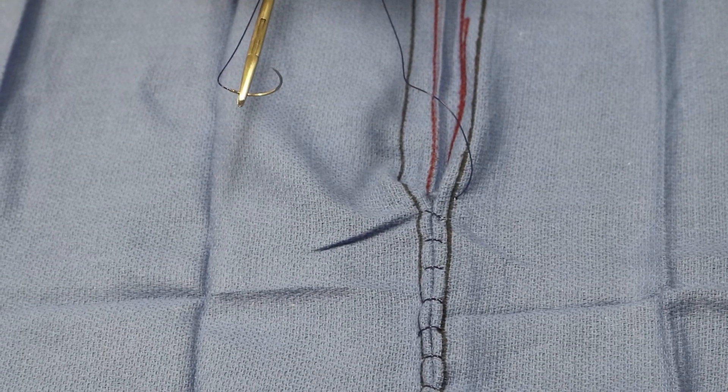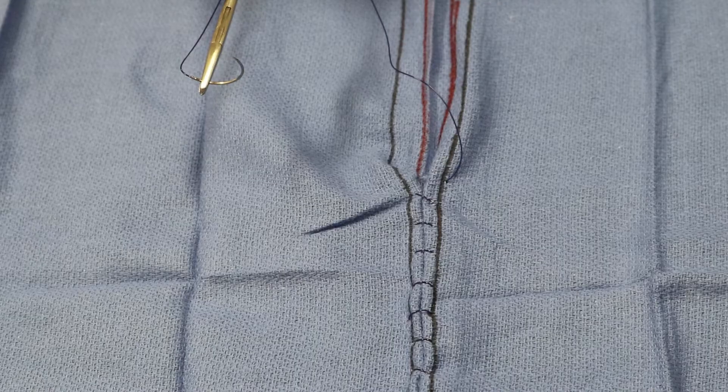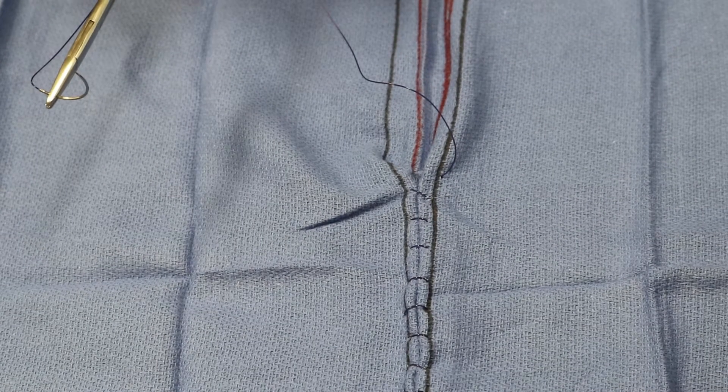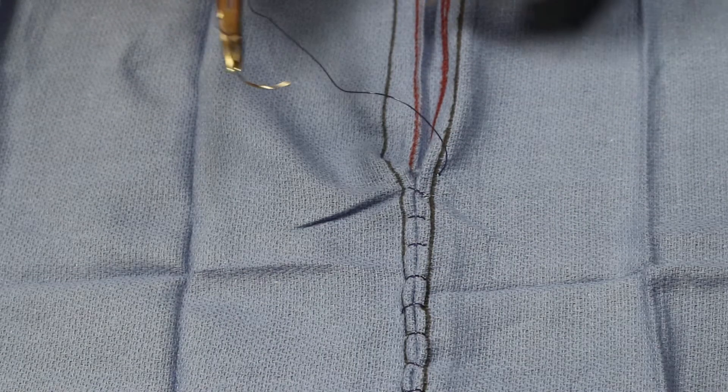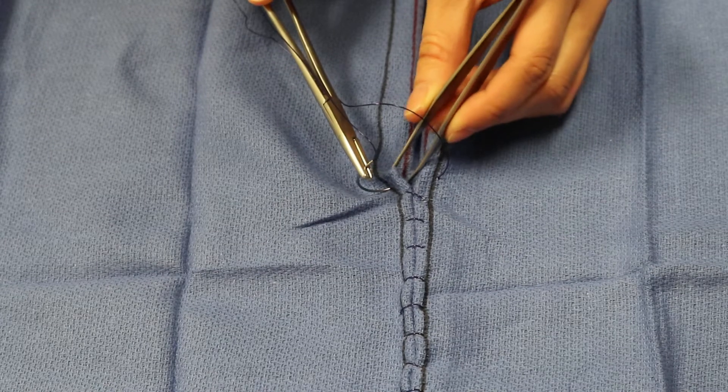Since this is the Limbert pattern and we know we've gone on our left side deep to superficial, that's a superficial bite and we cannot use that. So we'll take one more bite on the right side, or the dominant side, superficial to deep. You always want to get back deep to start your loop.